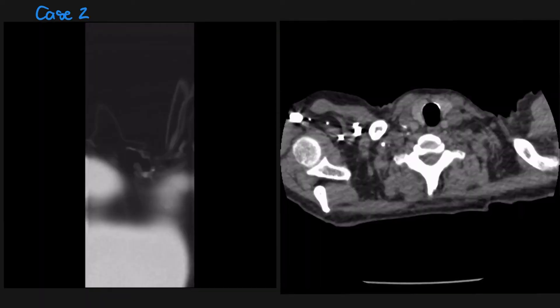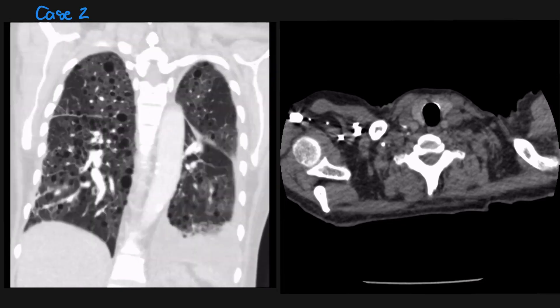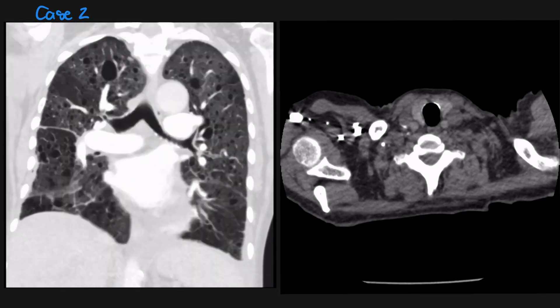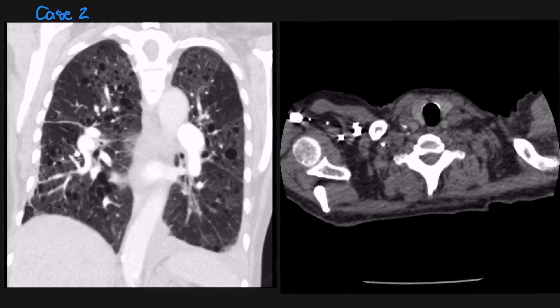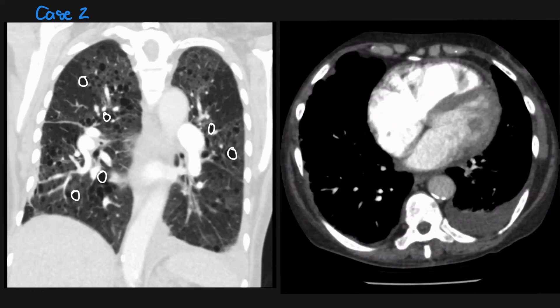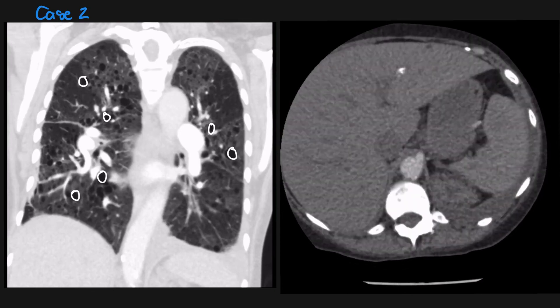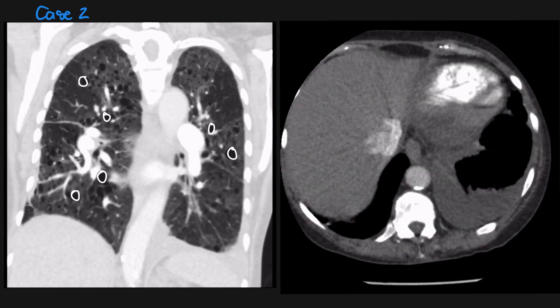The second patient is a 25-year-old lady who presents with a few days' history of shortness of breath. If we just stop on this particular slice, you can see that there are multiple cysts which are distributed throughout the lung with no particular predilection. And if we look at the images on the right and stop there, we can see that there is a moderate-sized left pleural effusion, which turned out to be a chylous effusion, and this is a patient with LAM.